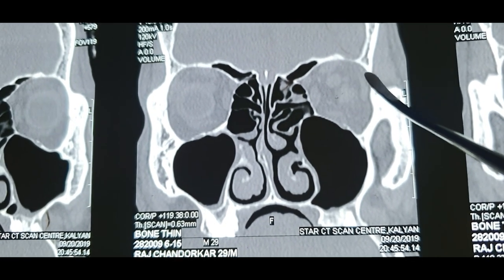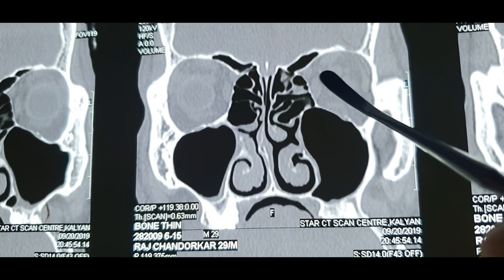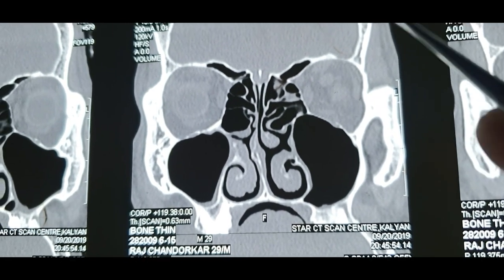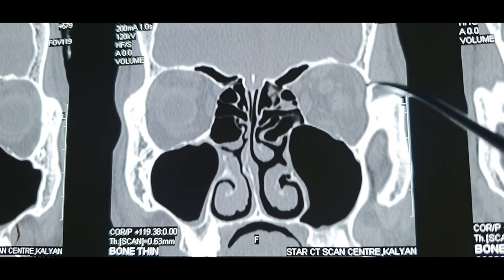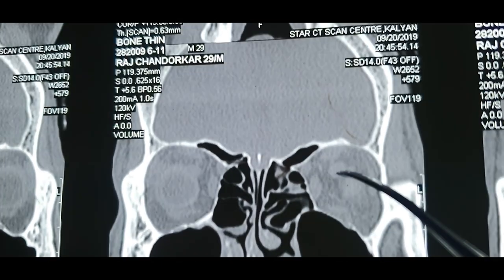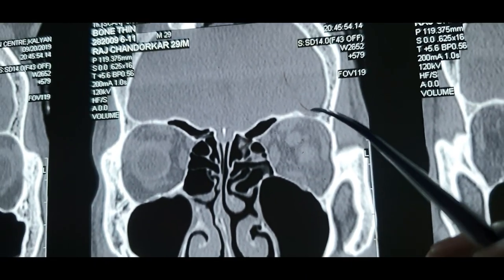In the orbit, as all sides are bony, it cannot expand. Max volume is 30 ml. Beyond that, it cannot expand. So within a duration of 10 to 15 minutes, if the blood vessel retracts, it will cause intraorbital bleeding and cause a hematoma. And directly you see this. What is this? This is the optic nerve. What will happen if the artery retracts inside and there is this bleeding and this is all bony? It will not expand. The optic nerve here will get compressed. And what will happen? Within 10 to 15 minutes, there will be complete blindness to the patient when he wakes up from the anesthesia. And you will have a huge globular swelling outside during surgery.